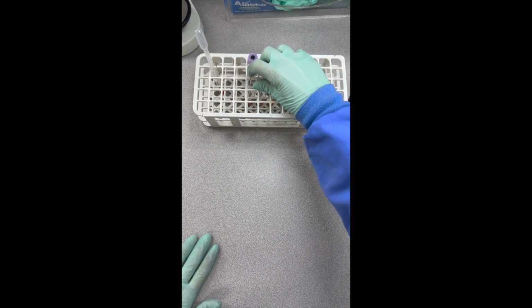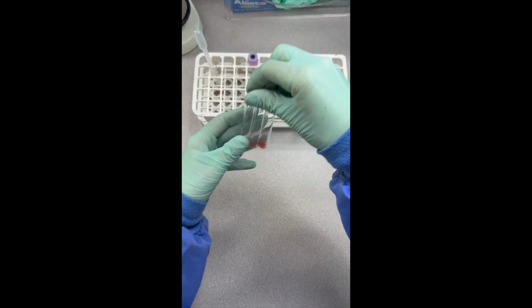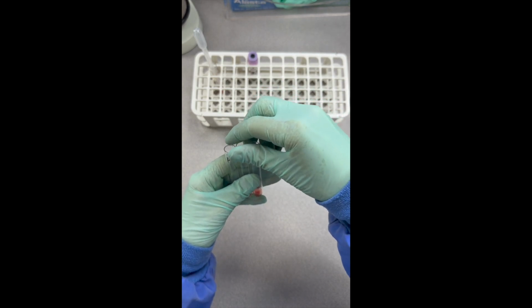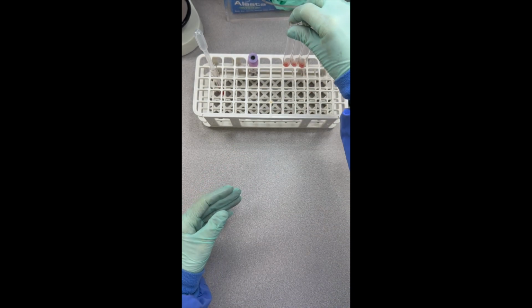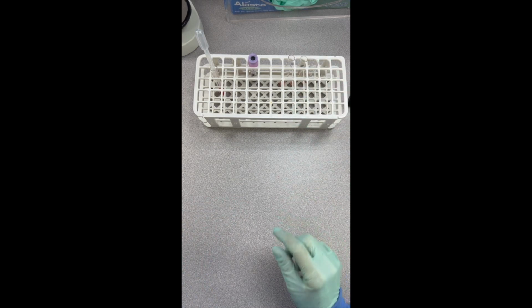Okay, time's up. So our tubes have sat here and incubated at room temperature for 5 minutes. And now what we need to do is we need to go put these in the cell washer and wash them 4 times with saline. And we'll talk about what's going on when we do that. So I'll be right back.